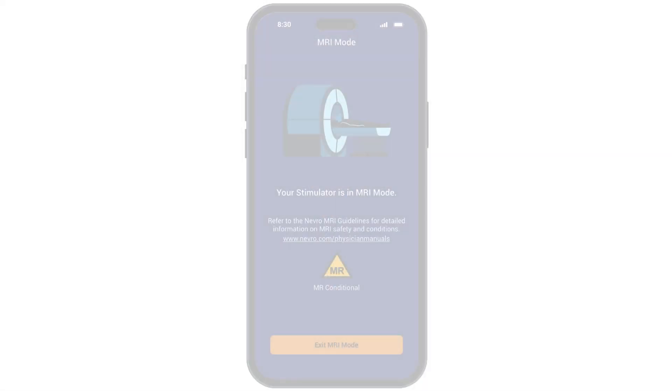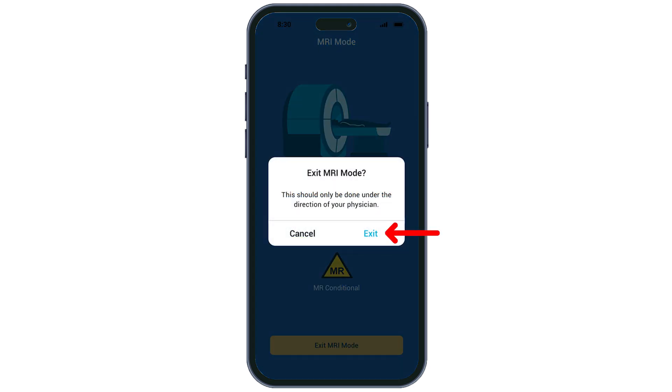Once your MRI is complete, you will be able to exit MRI mode. To do so, tap the exit MRI mode icon on the bottom of the screen. You will then be prompted to tap exit.